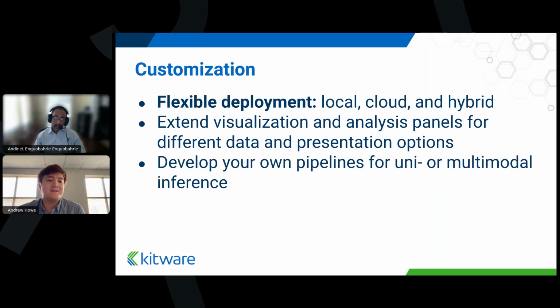So the purpose of the viewer is for a researcher or physician to interact and observe the patient as a whole. While doing this, VolView Insight provides the opportunity to package and send data to the backend. In our case, we've done a segmentation model, which is image only, the database model, which was just the EHR data, and then we have that multimodal model. And the difference between running these models from VolView Insight's front end and on in-house data, like maybe you want to run it on an in-house data corpus.